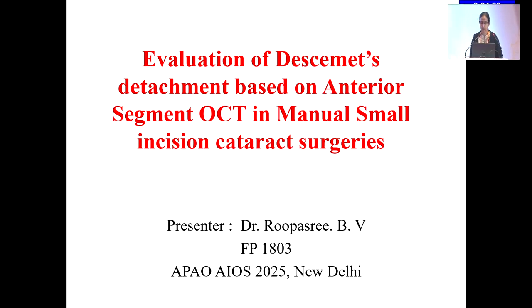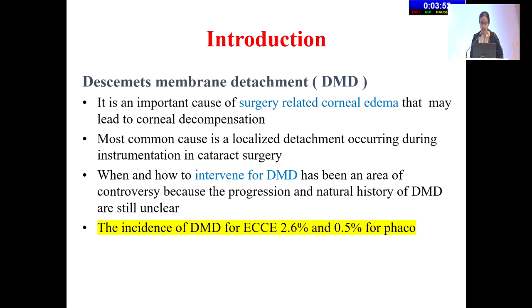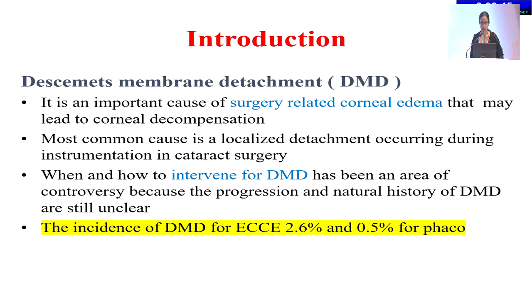Good afternoon. I am going to present on the topic: evaluation of Descemet's membrane detachment based on anterior segment OCT in manual small incision cataract surgeries. No financial disclosures; ethics committee approval was obtained. DMD is an important cause of surgery-related corneal edema that may lead to corneal decompensation.